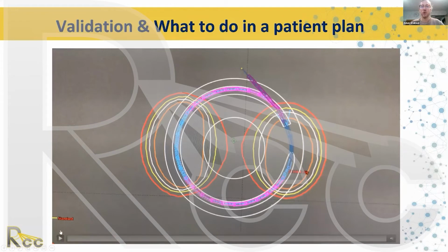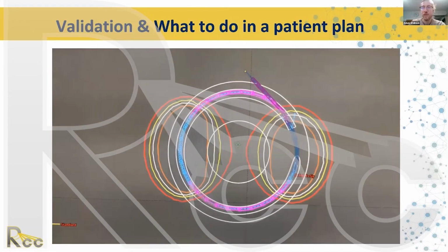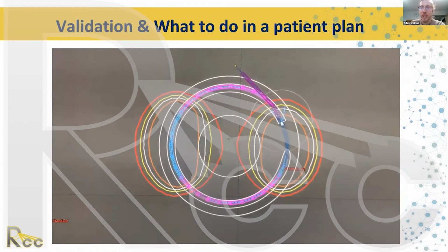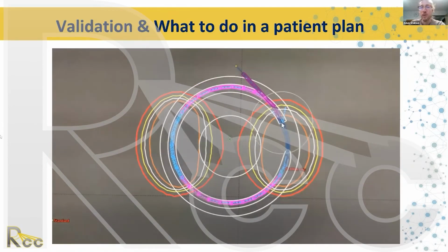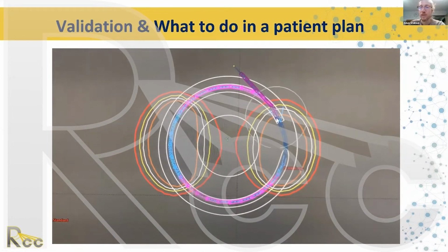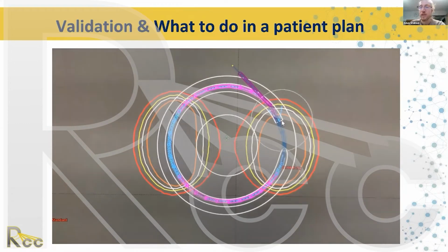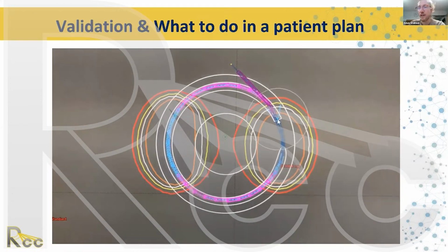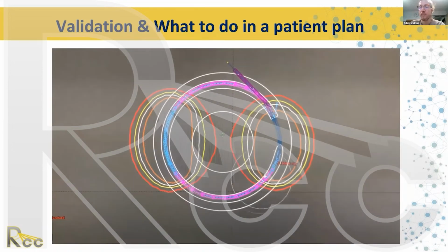So here's another quick video I'll show you, which tries to explain some of this. Again, this is the delivery of a backward stepping ring. Here we've reconstructed the ring properly. The arrow shows the edge reconstructed at the edge of the inner lumen, and the source moves around that path length.